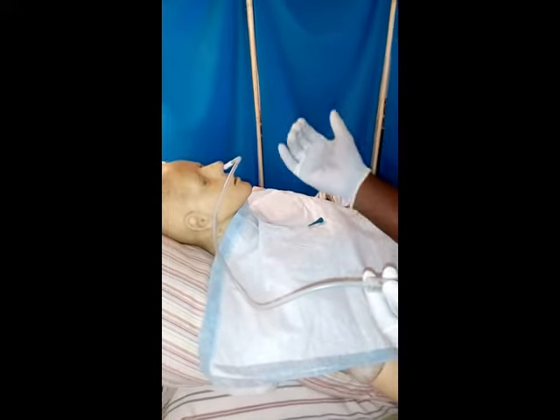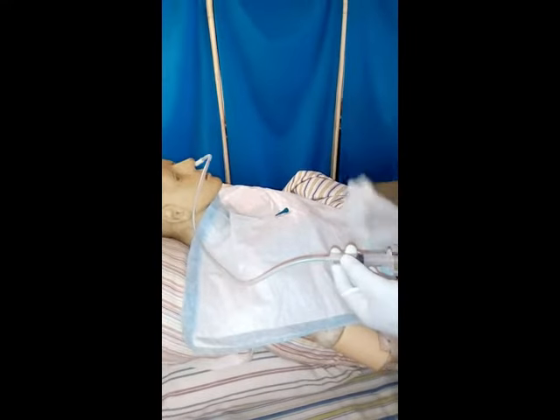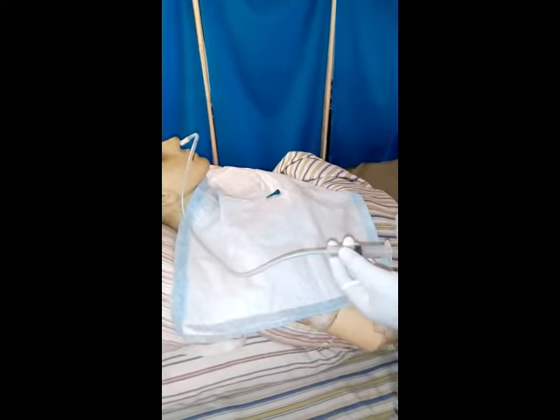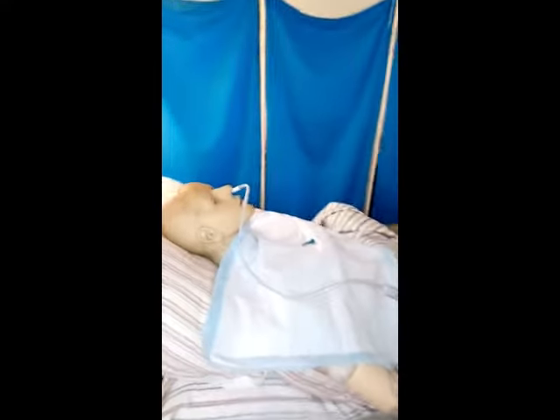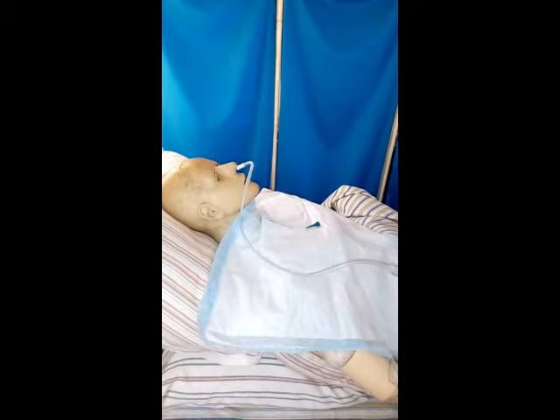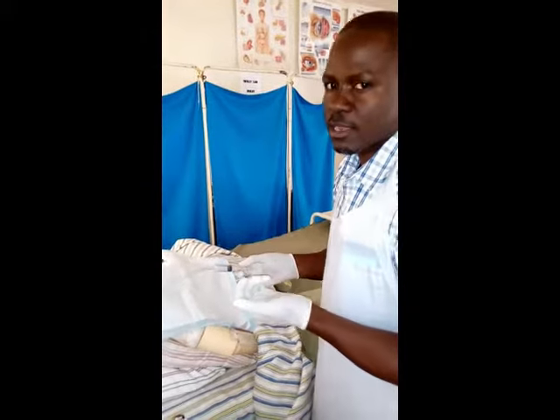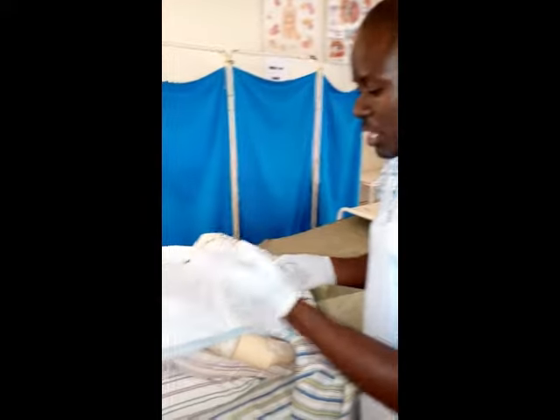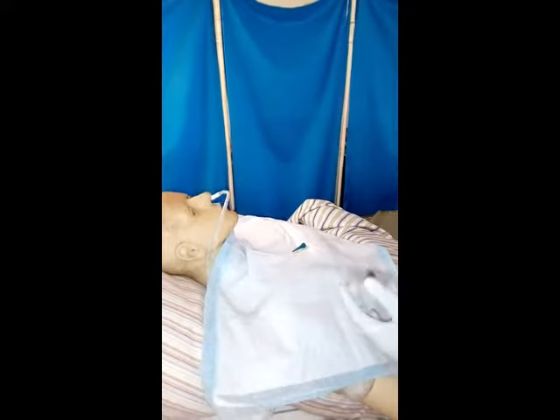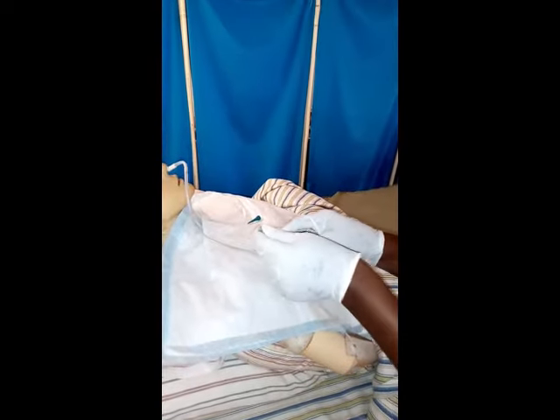If it's not there, meaning it won't show, it won't come, then you're not there, and you need to call a second person to verify with you. Or if the patient is becoming restless, meaning they are failing to breathe, you know that maybe it's in the airway, so you need to remove it, or you call the second person to assess with you. If you find that the patient is restless, you have to just remove and try again. Another person can verify with you if you're not sure. After having seen gastric content flowing back after aspirating like that, you have to at least occlude it.